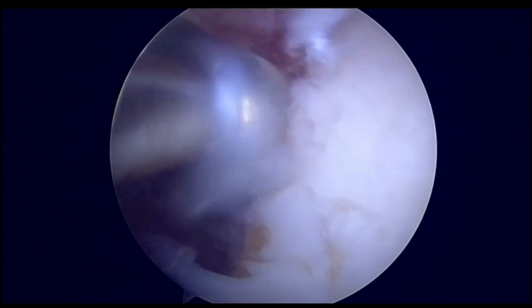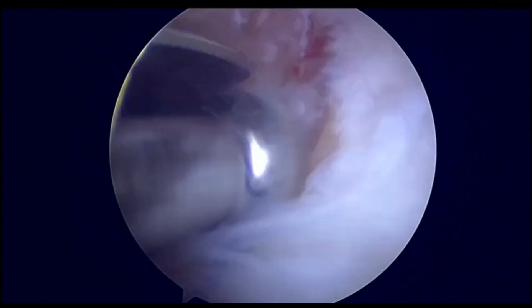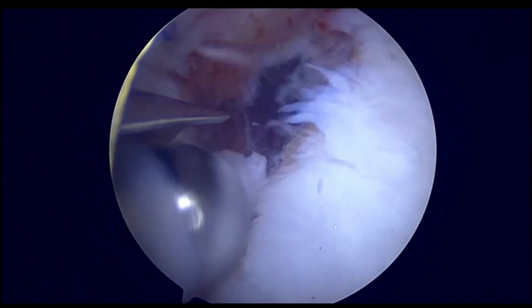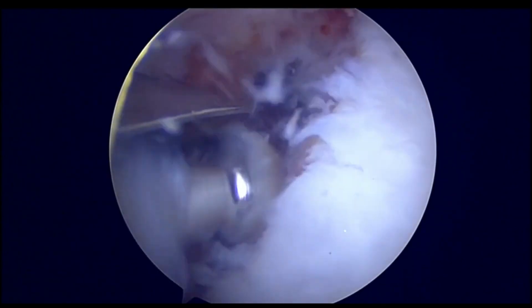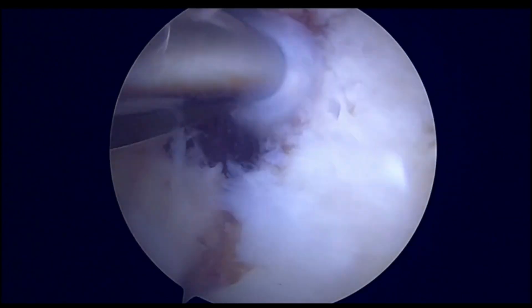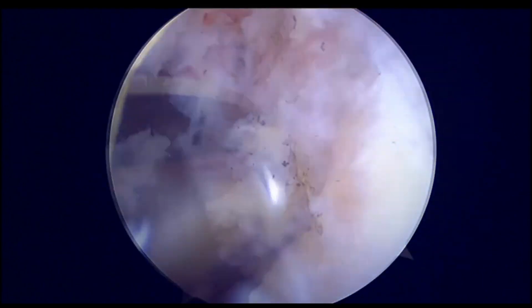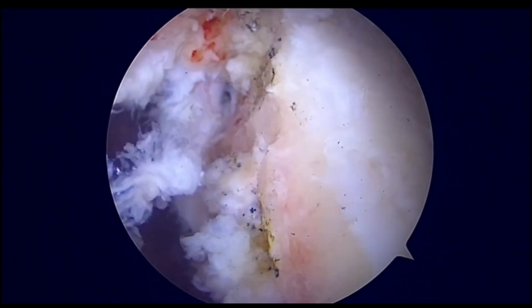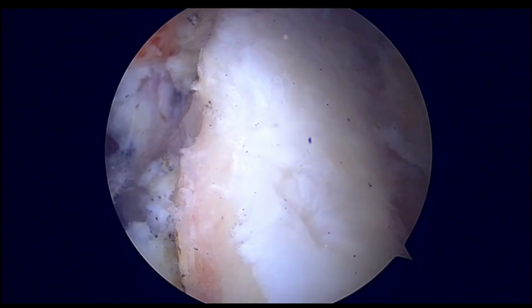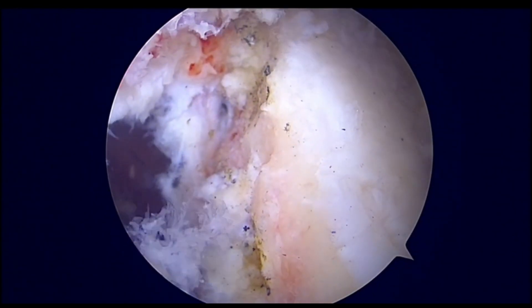Here what we can appreciate is a very good bleeding surface which is present now. The distal clavicle bone block is a very good graft, harvested similar to the Mumford procedure, and the size and dimension of the graft can be changed as per our needs.